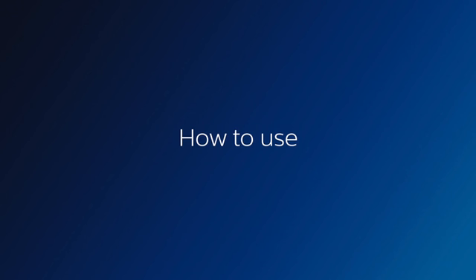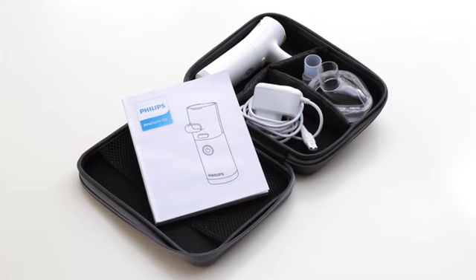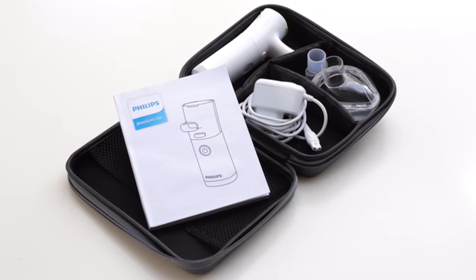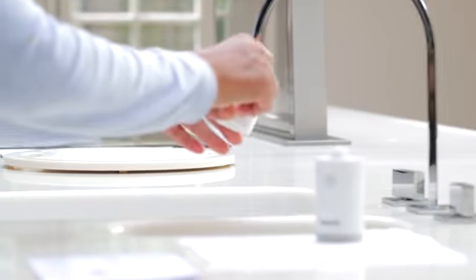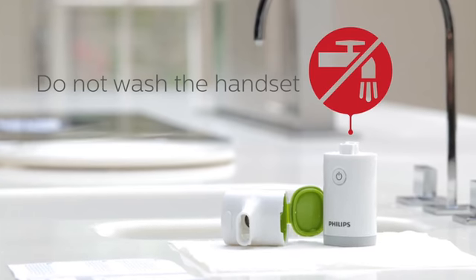How to use. Unpack your nebuliser and check you have all the items listed and that nothing has been damaged. Please carefully read the instructions for use before you use your Inaspire Go for the first time. Before your first treatment, clean the mouthpiece following the cleaning instructions and then fully charge the battery.